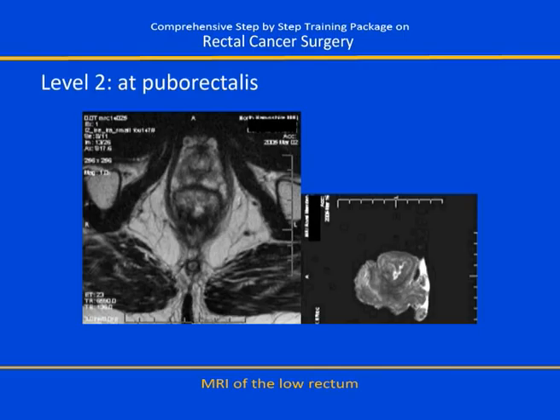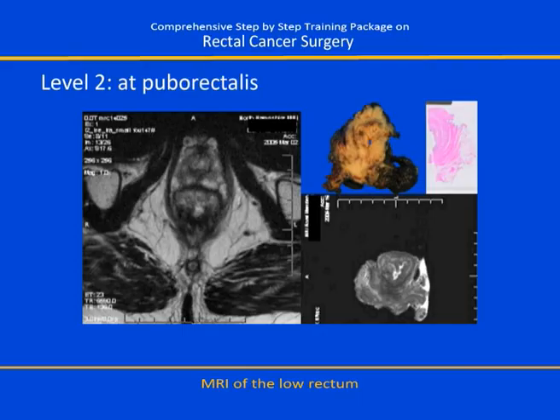So the fact that the muscularis propria is forming the anterior border of the specimen is not a serious problem, because the tumour was never going to be there and there was never going to be a positive margin at this site. So this is really what the potential is in terms of patient gain: you can start to tailor the planes of your surgery and the radicality of your surgery according to what you know is tumour, also bearing in mind the possibilities that you can preserve organ function and nerve function accordingly. And so this would be an example of how that could be achieved.